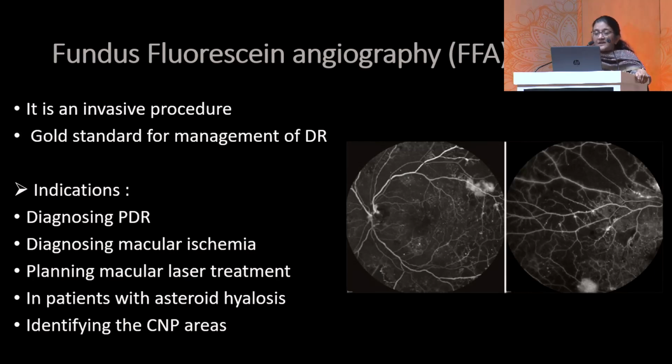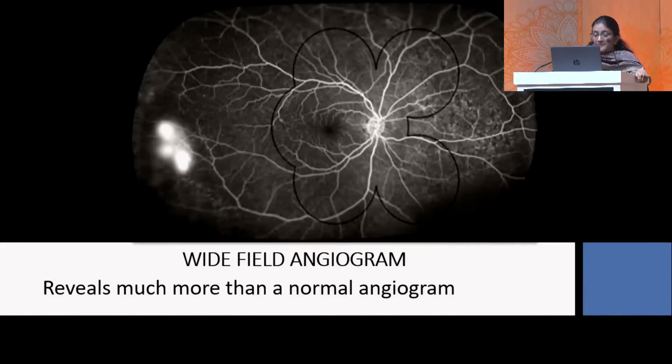Coming to fundus fluorescein angiography, we have to remember it's an invasive procedure, so it cannot be taken lightly. However, it still remains the gold standard for management of DR. There are various indications for performing an invasive procedure like FFA, which does have a potential risk of various complications. So we have to know when to really indicate a patient to undergo an FFA. But the importance is that in today's time, we have wide field angiograms, and they are revealing much more information about the peripheral changes of DR rather than the typical ETDRS field that we were using initially.